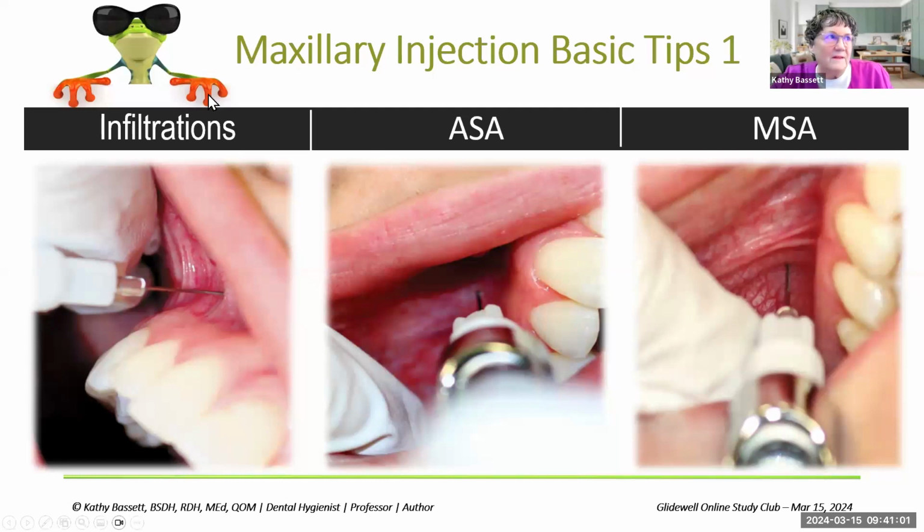And if you lift the lip upward and then kind of outward, like you're creating a backsplash, it literally lifts the tissue up and it opens up that pathway. And so on that insertion, you're less likely to bump against periosteum. And then really looking at that person's maxillary slope and getting parallel to that bone avoids contact with the bone, because we don't have any intention to make contact with bone. It's not necessary for these injections.